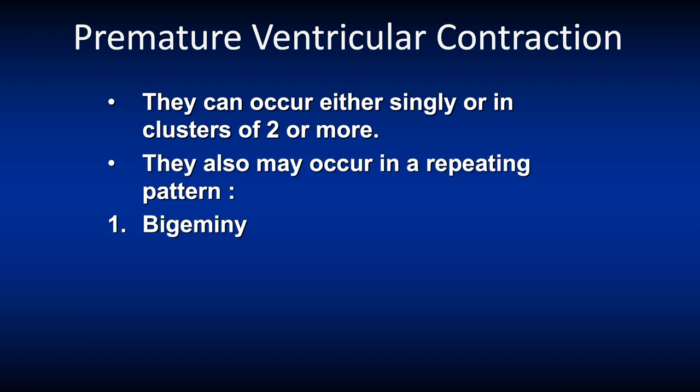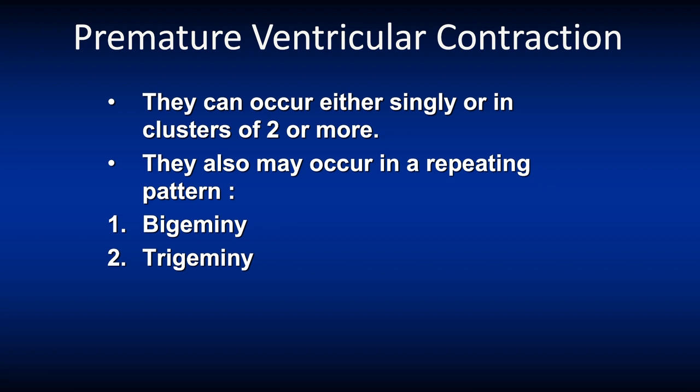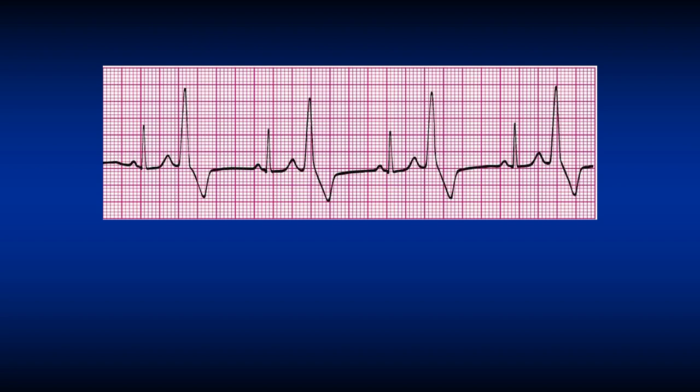You get bigeminy, trigeminy, and quadrigeminy. Here we see one normal sinus beat and then a PVC, one normal sinus beat and another PVC, and this pattern continues throughout the strip. This repeating pattern is called bigeminy.